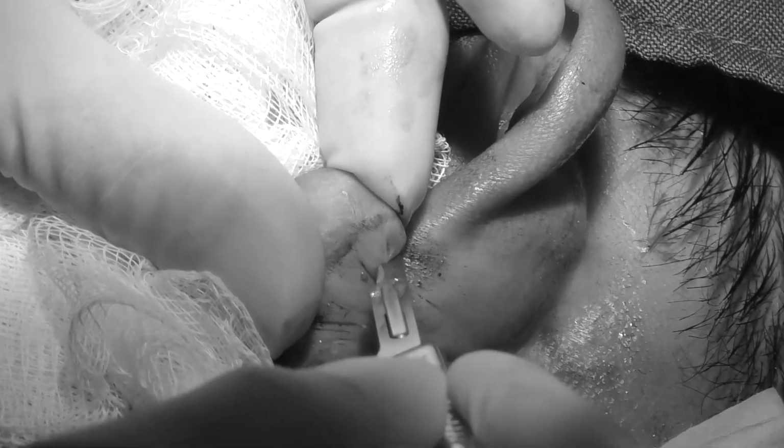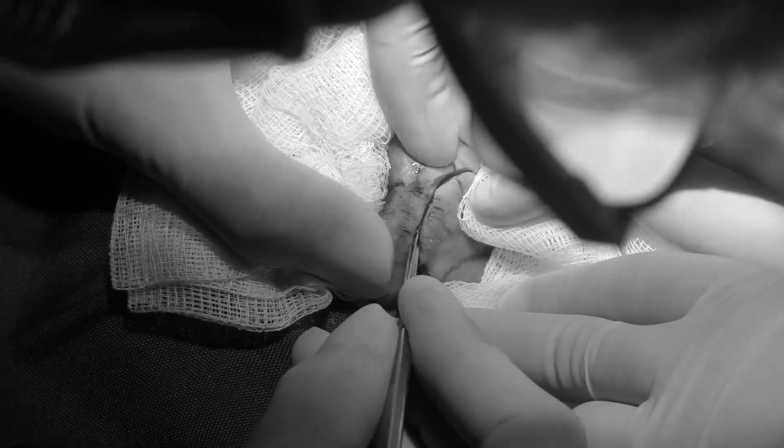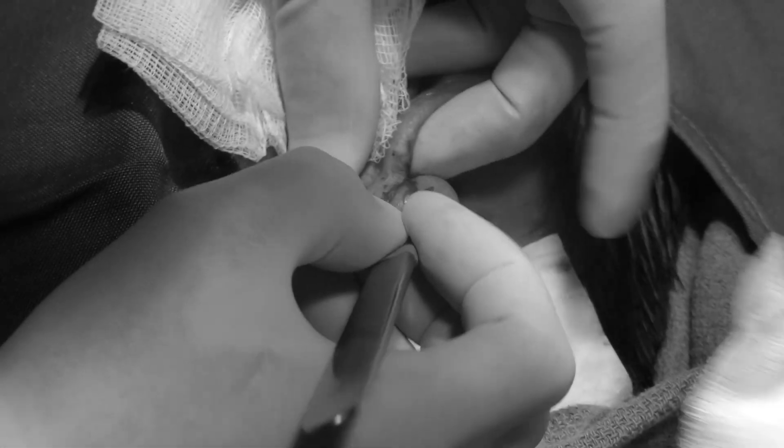We start the incision posteriorly. Then we make the anterior incision.